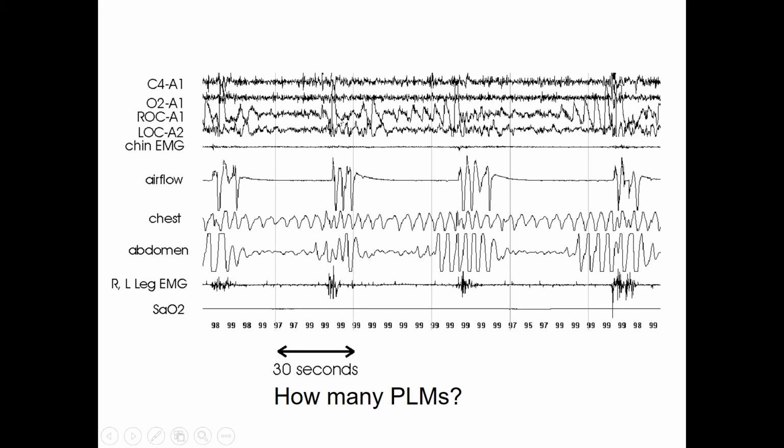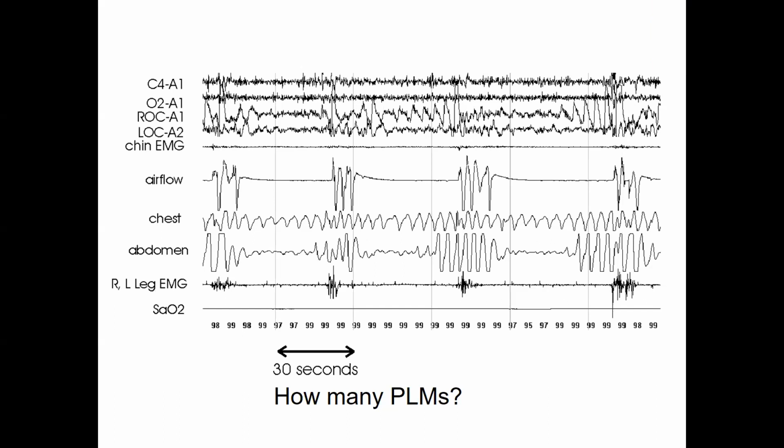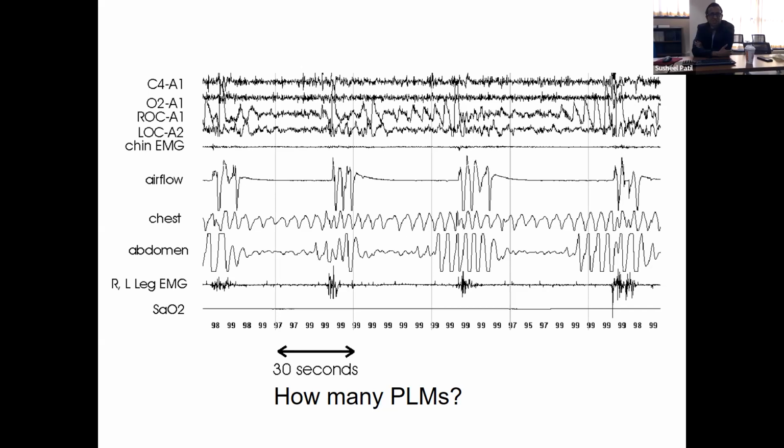I have a question about this. I remember this rule. Does it ever happen that a leg or limb movement triggers an apnea or hypopnea, or has it never happened that way? It's always done the other way around. It's a good question. I suspect that you will sometimes see that occurring, but because of the way the rules are set, you will not be able to score it as such, because the presence of the respiratory event is going to trump those leg movements.